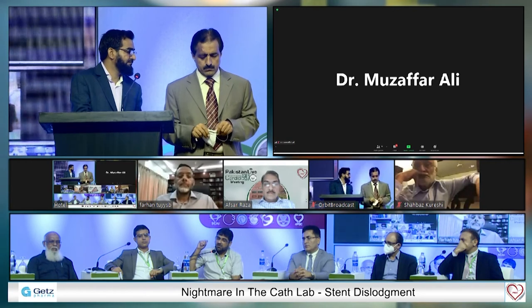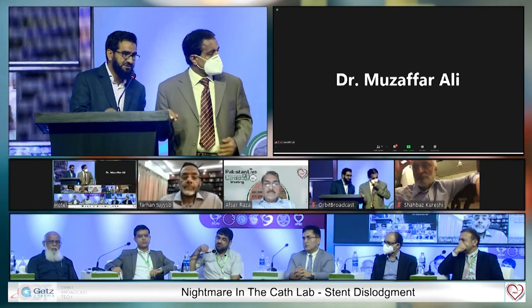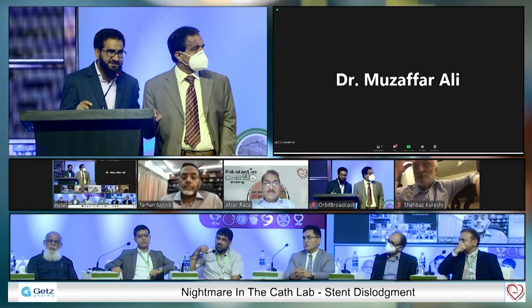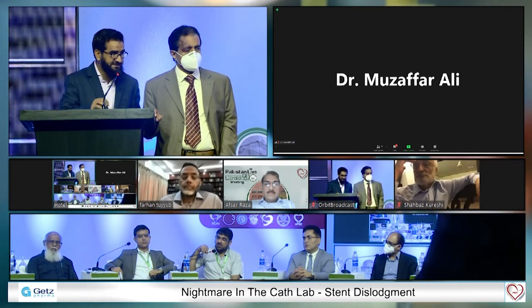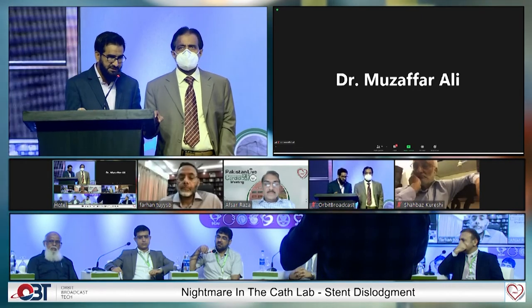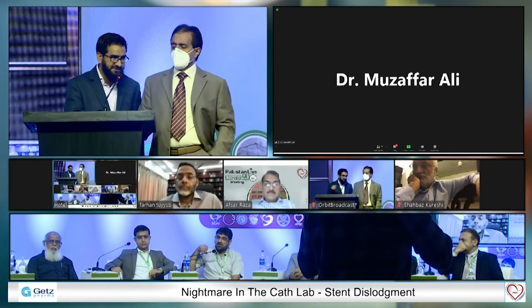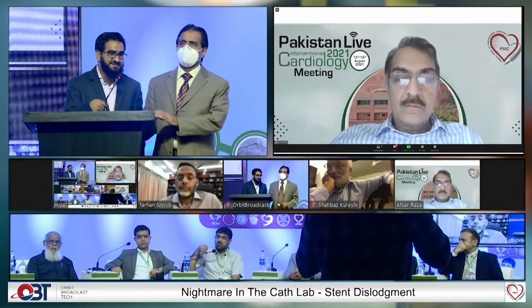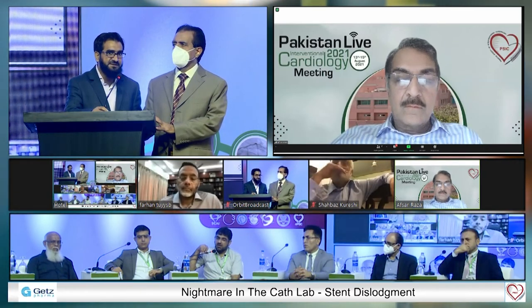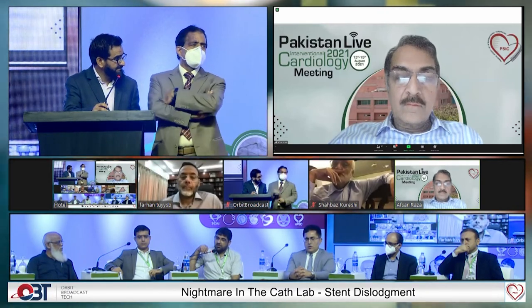I saw that when the balloon was in the middle of the stent, it did not cross distal to the stent. So I opted for the other option. My goal was to cross the balloon beyond the stent, then inflate it and pull the whole assembly back so that the stent could be retrieved. But the balloon did not cross the distal part of the stent, so I quit that balloon.